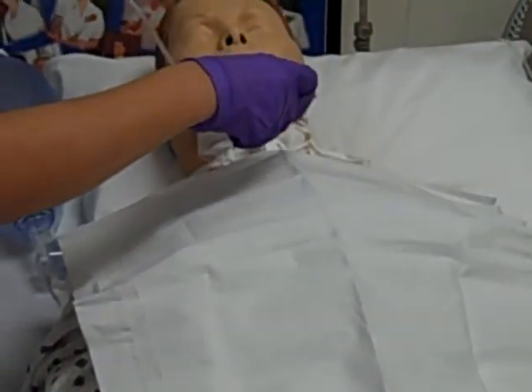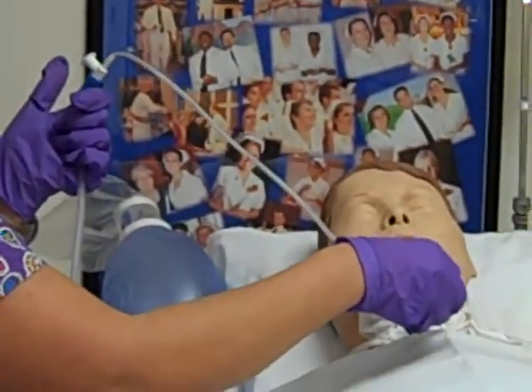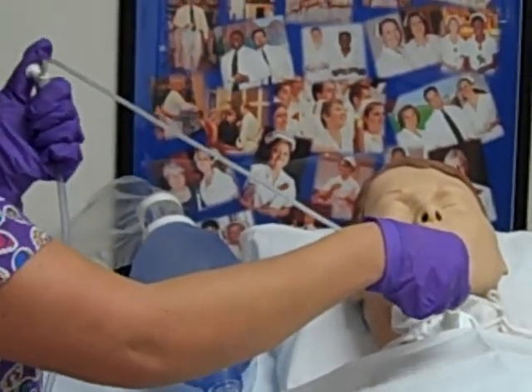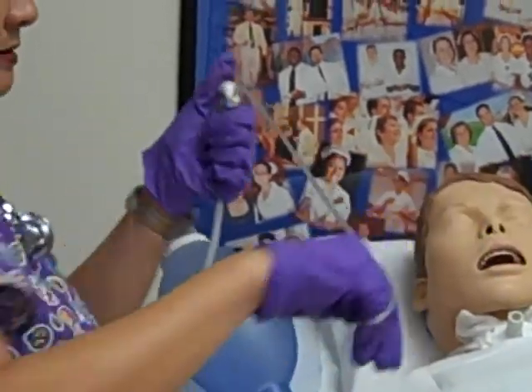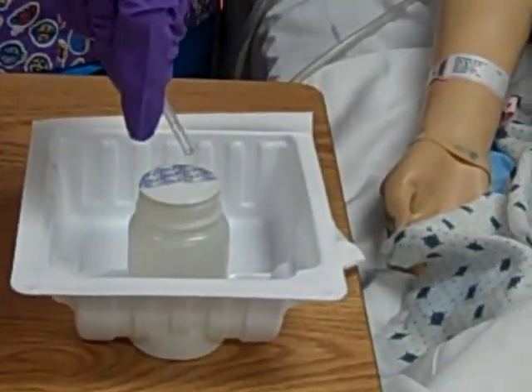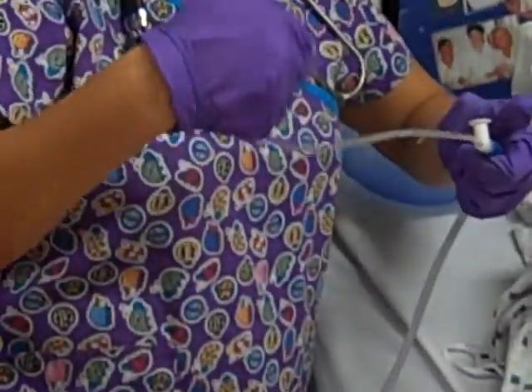No suction on the way in. Five inches or until I meet resistance. Intermittent suction on the way out. I'm going to clear my catheter and wrap it back up.